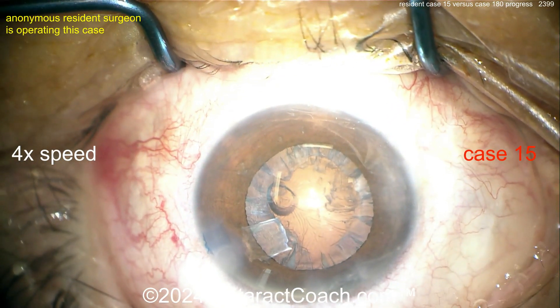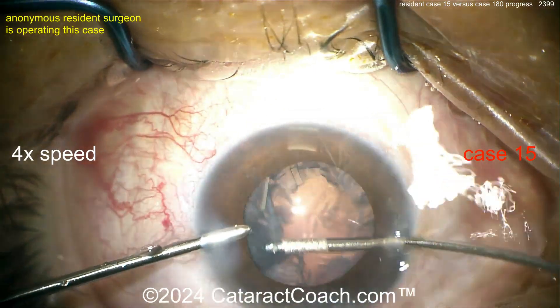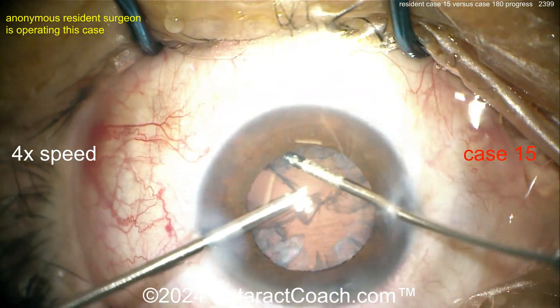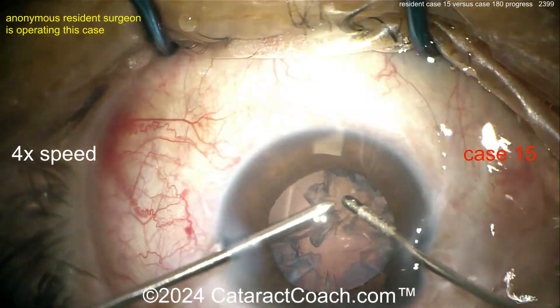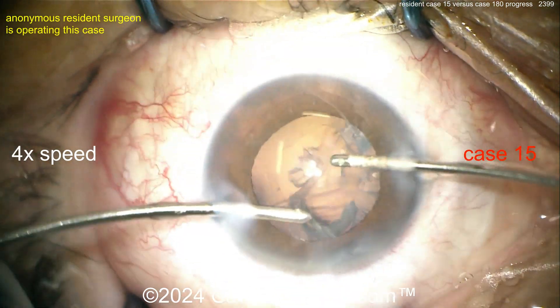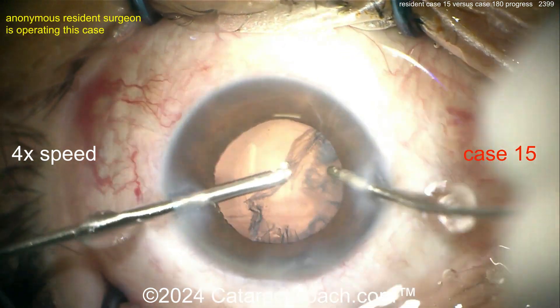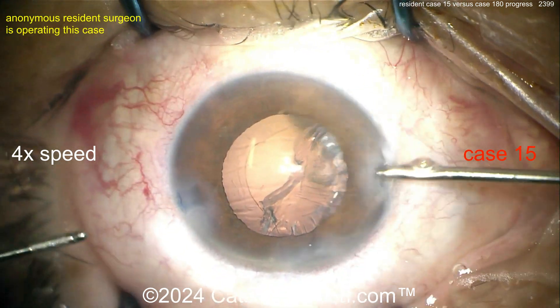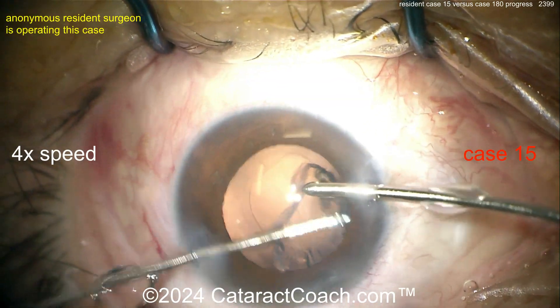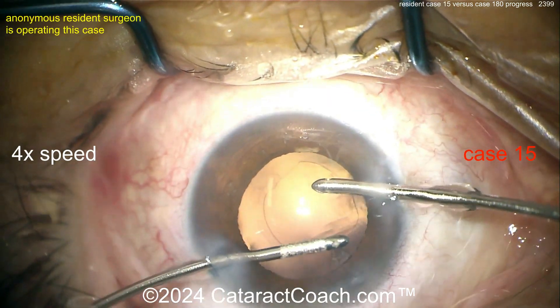Whoa, whoa, whoa — you gotta hold there in the epinuclear shell. Careful, that can go right through to the posterior capsule. Okay, maybe that's a case 15 kind of mistake. Manual I/A — good use of both hands here. Let's see how the second hand works if you switch hands. Now the aspirator is in the right hand, infusion in the left. Taking that out pretty nicely, very easy. This looks like a pretty clean capsule and the rhexis looks intact.